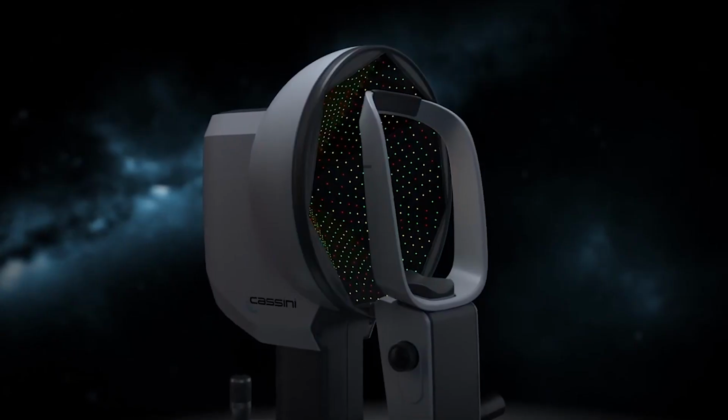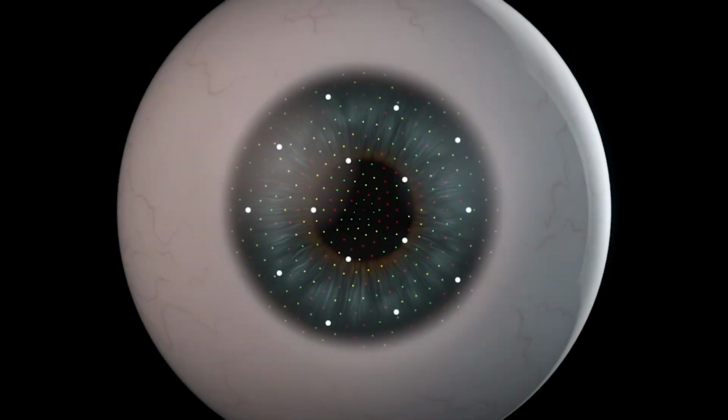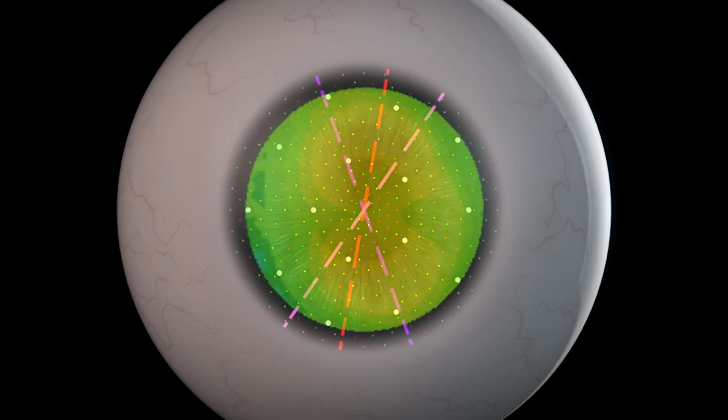The Cassini Ambient is a diagnostic tool that does a few things on the preoperative side for cataract surgery. Number one, it can do a surface dry eye assessment. Number two, it can get a corneal topography plus total corneal power to help that surgeon plan what is the best astigmatism management for that particular patient. What makes it unique is it's gathering information for the total cornea. So it's not just the anterior cornea, but it's the total corneal power, which is critical when determining which toric lens power you're going to place.